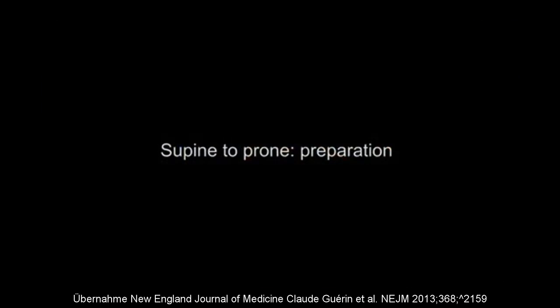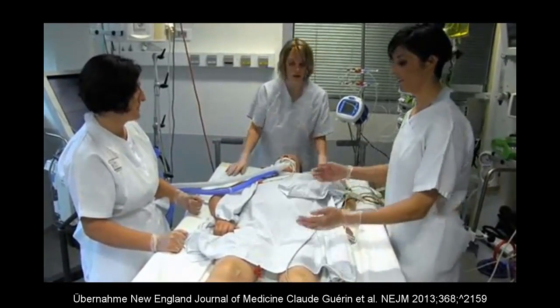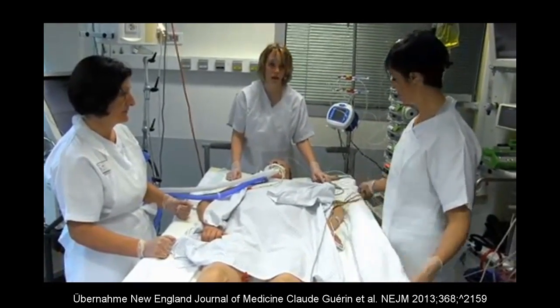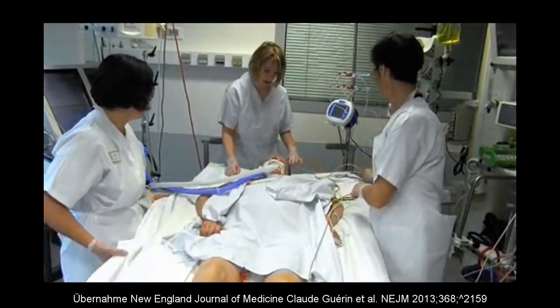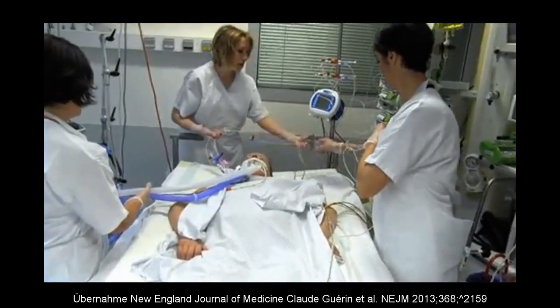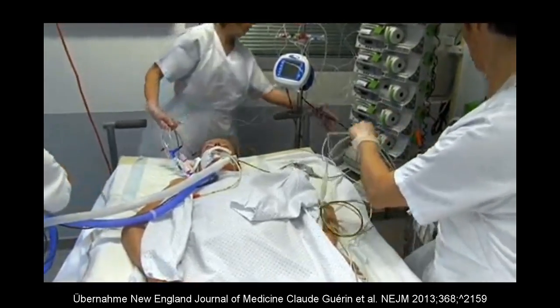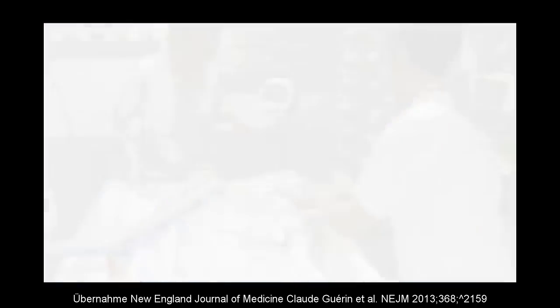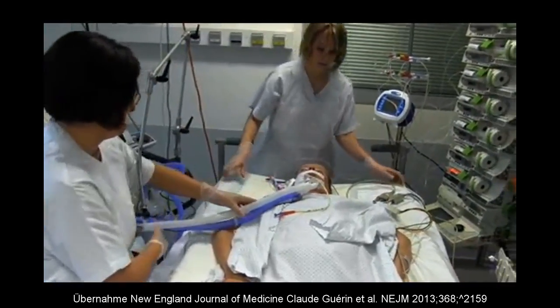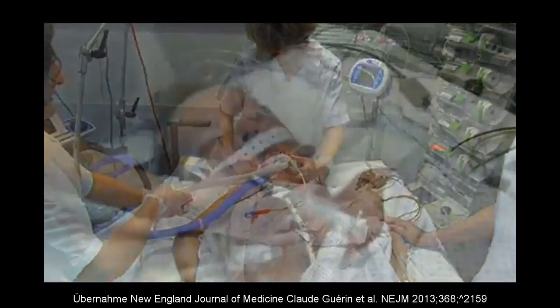The first step is to prepare the procedure. At this stage, you have to decide which direction to turn the patient, to the left or to the right. Priority is given to whichever side the central venous lines are located. Check the length of the vascular lines and the transcutaneous saturation cable to be sure they are long enough. Move the ventilator as close to the patient as possible. Check the patient's hemodynamic status and the level of sedation.